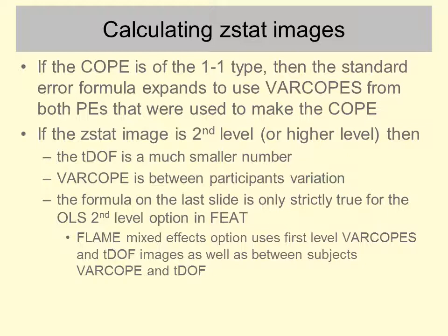If you're using the FLAME mixed effects option, then it's more complicated, and calculation of the z-stat uses both the varcopes from the first level and the second level, and also the TDOF images from the first level and the second level.